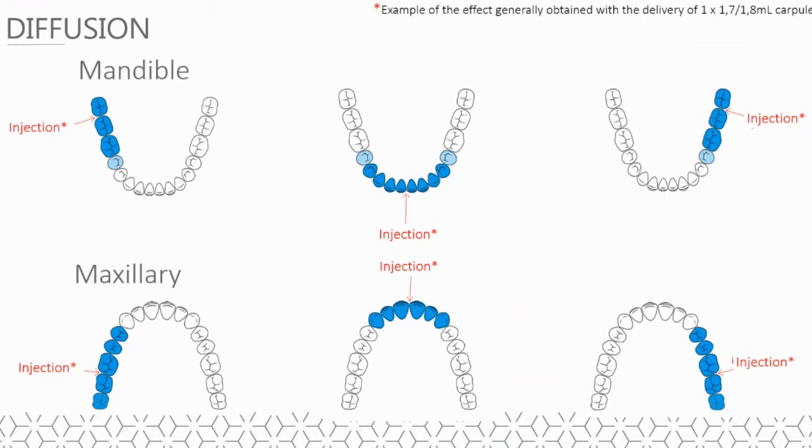Choose the injection point distal to the tooth to be treated, especially for teeth devoid of pulpal circulation or inflammatory tissues. For asymptomatic teeth, a mesial intraosseous injection will also provide sufficient local anesthesia for the tooth just distal to the injection site. In the maxillary, the diffusion is distal and mesial. Choose the injection point which provides you the easiest access.